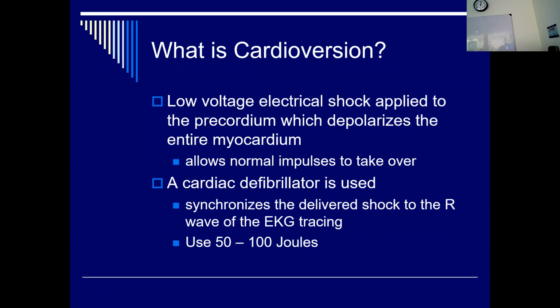And I just have some notes written. So respiratory is called to stand by for cardioversion, just in case the rhythm converts to asystole or another lethal rhythm. It's part of the respiratory therapist's responsibility for airway. If the patient's not breathing, you start bagging. And then of course, no pulse, start compressions. A lot of sedation is given, usually Versed, because it erases the patient's memory of the procedure. But Versed may suppress respirations. So make sure during the procedure that you're monitoring O2 sats and end-tidal CO2.